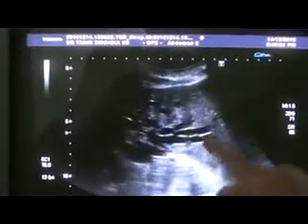You can see the dilation of the intrahepatic bile ducts all over, and they reach the periphery of the liver. This is the left lobe. You can see the serpentinous dilation of all the intrahepatic bile ducts that reach the periphery of the liver.